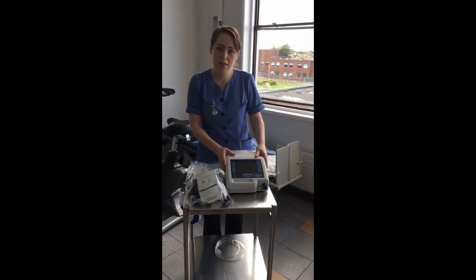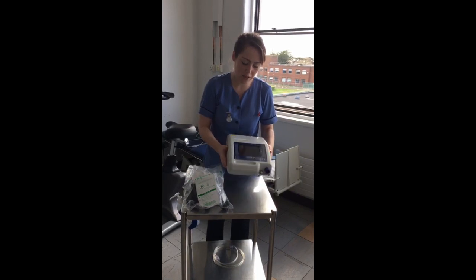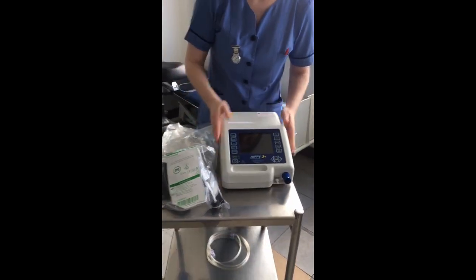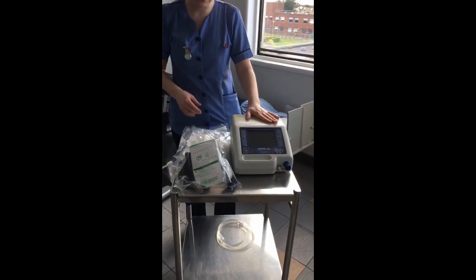I'm going to show you how to set up BiPAP. For the purpose of this education, it is a Nippy 3 Plus machine that we're using for the setup. I'm going to show you firstly the equipment that we need in order to have an appropriate setup.